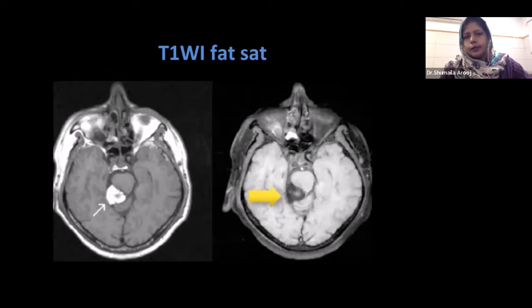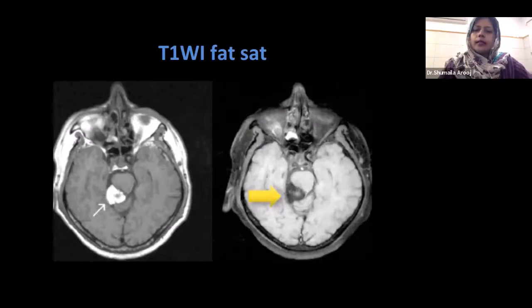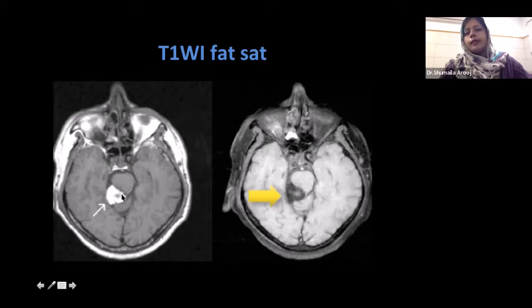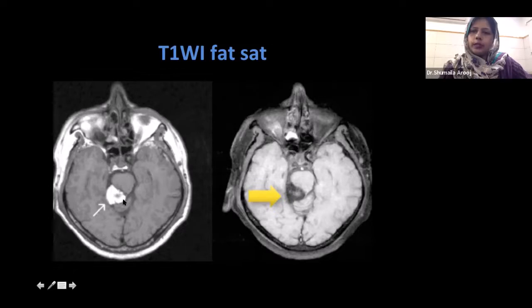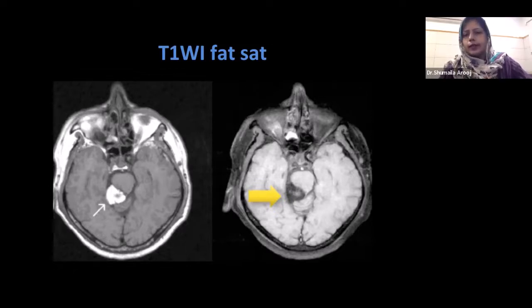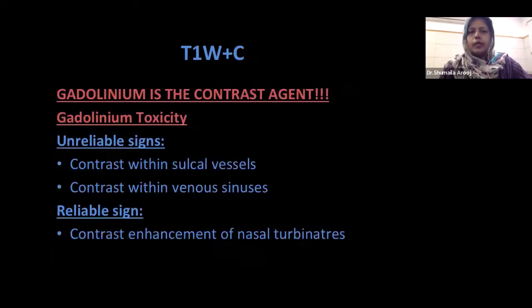Another example of fat suppression images: this was a patient who presented to us and there was an incidental finding of a T1-weighted bright signal intensity area in the region of the right tectal plate. When we performed fat-sat images, all of this suppressed and we showed that this is a congenital lesion and an incidental finding, and it must not be causing symptoms to the patient.